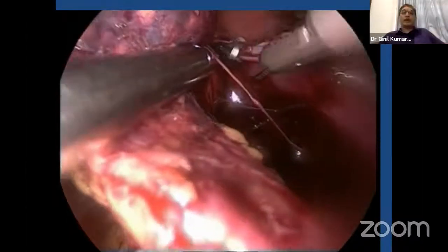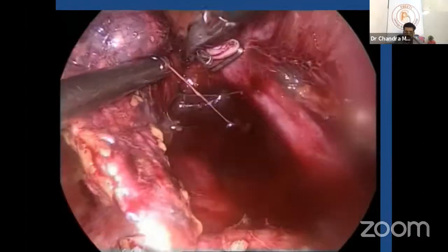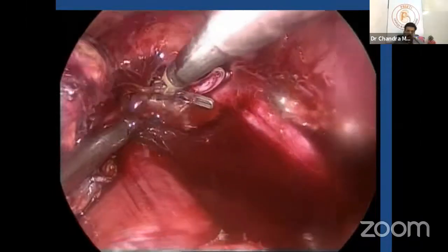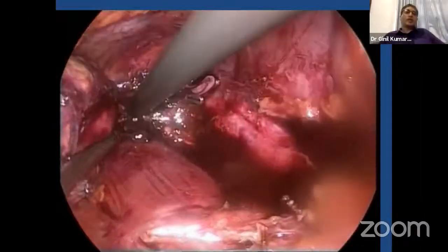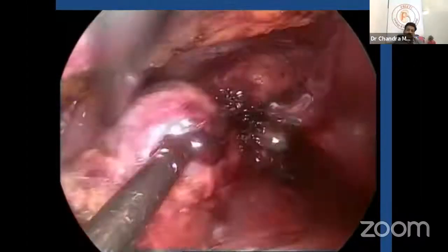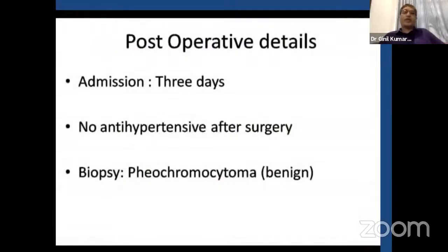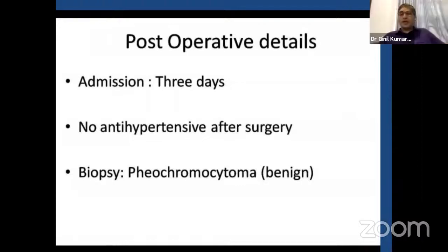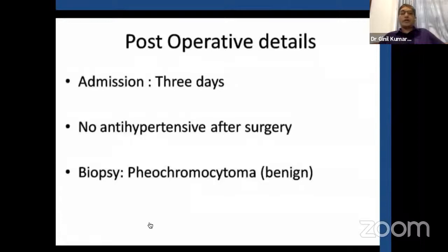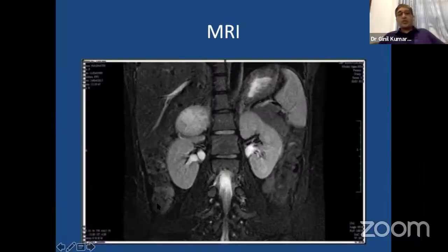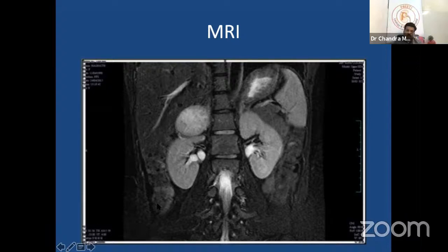If you have a good anesthesiologist and good team, BP fluctuation is not a problem with present-day management. The bleeding from the IVC side is more important — double clip the adrenal vein. Sometimes there can be an extra small vein. The clip applicator is a metal clip applicator. Occasionally I use LigaSure but that is not very much needed. You are sharp onto the structure — whether it is nephrectomy or adrenalectomy, you are plumb on the structure; like in the kidney you are plumb on the artery, then on the IVC, and you can tackle the vein without much issue.